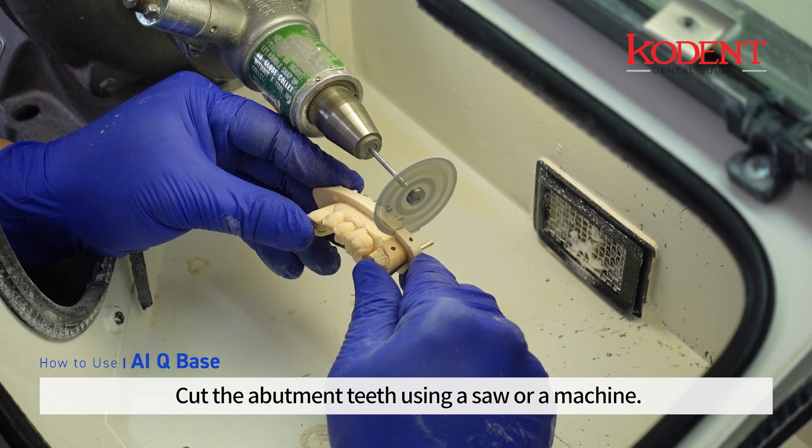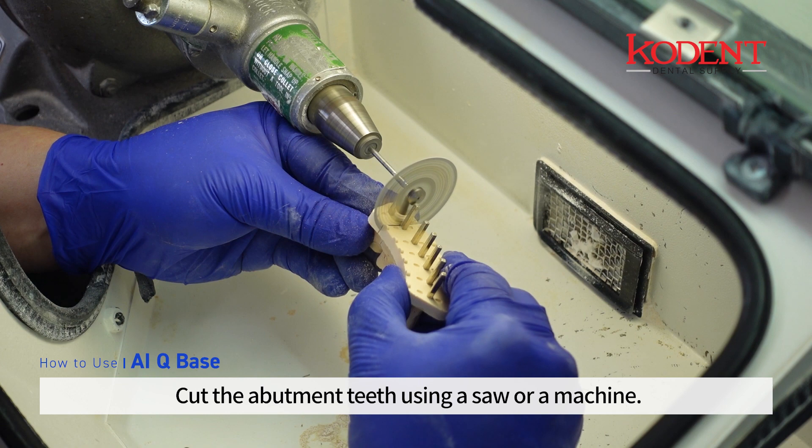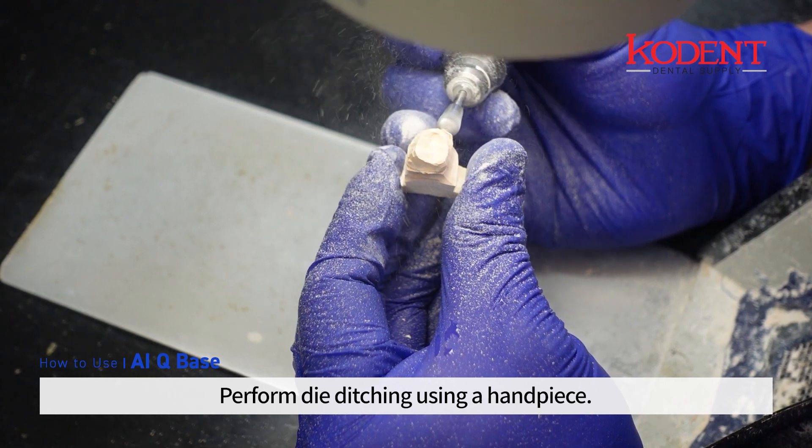Cut the abutment teeth using a saw or a machine, then perform die ditching using a handpiece.